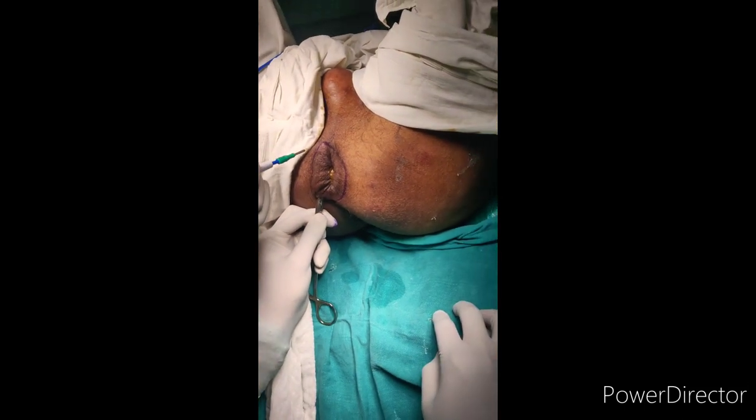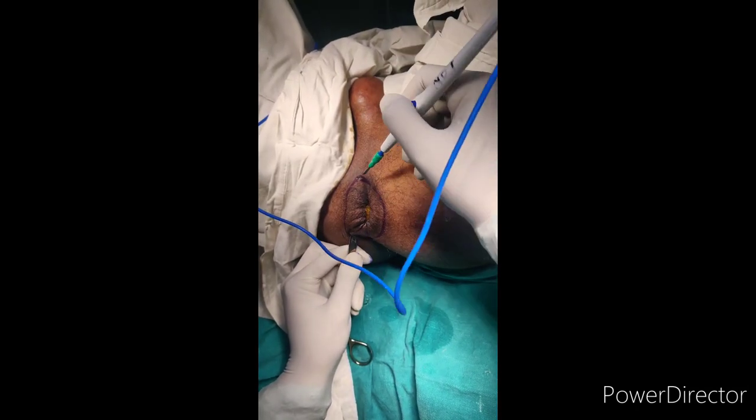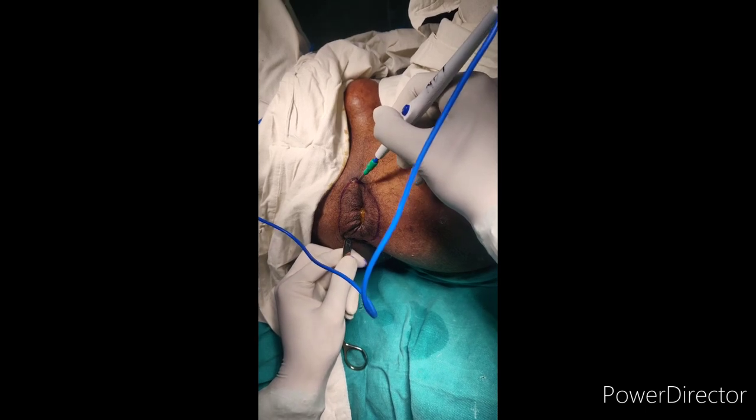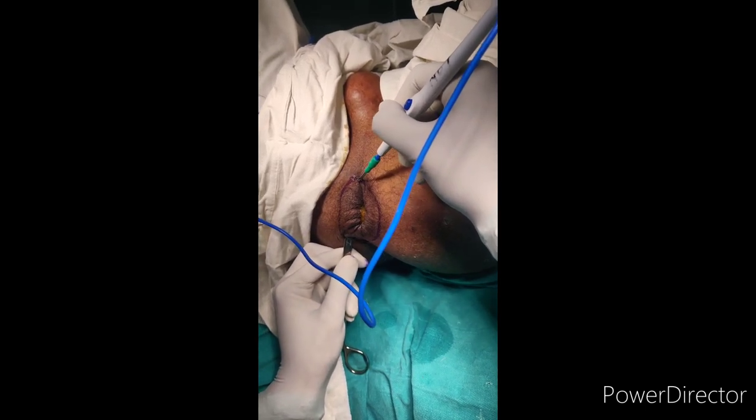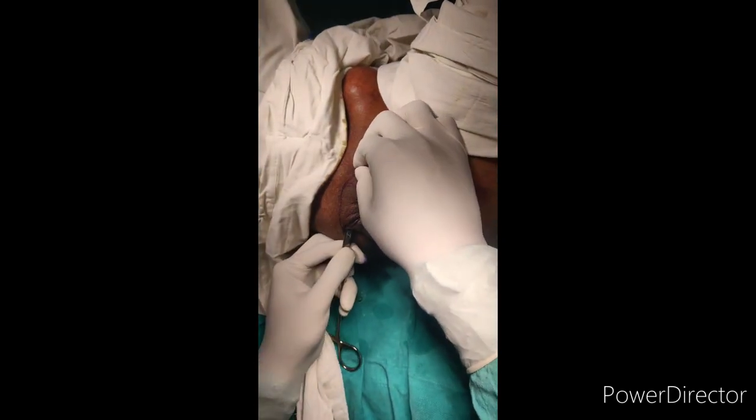We will be coming from the upper point, that is the exit point. From this point we will be coming out and passing our suture — Prolene. Prolene number one is used in this procedure. We will be passing the suture from that point.